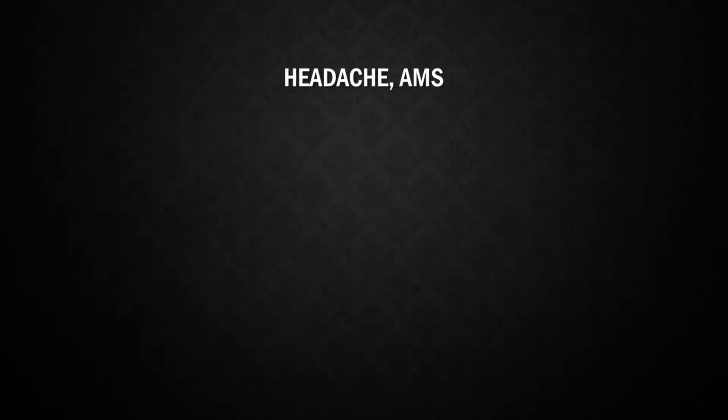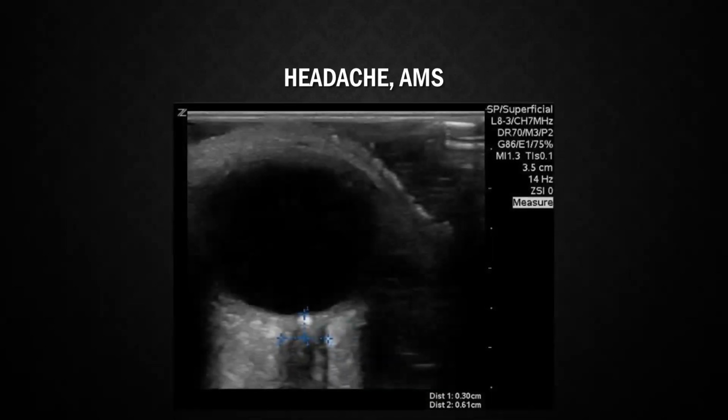Okay, so ultrasound and headache and altered mental status. So if you have a concern for elevated intracranial pressure, this is actually something that's good to utilize in order to see if there is evidence of elevated intracranial pressure by measuring the optic nerve sheath diameter. So this can be used in patients with an intracranial hemorrhage, or if they're presenting with headaches and you suspect maybe they have idiopathic intracranial hypertension, or if they have a brain mass of some sort and you're concerned, then you can utilize this.